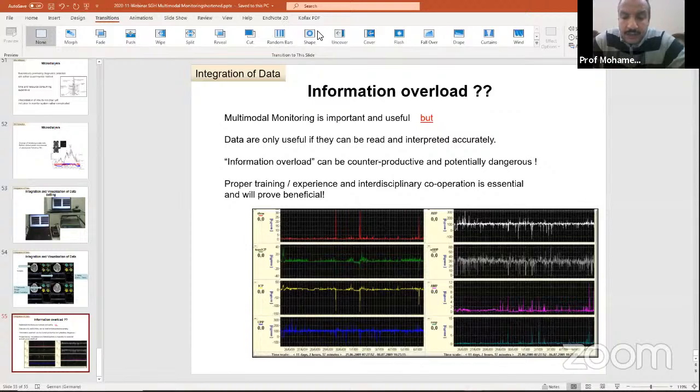You mentioned in your first slides that there is no replacement for the clinical examination. So if your readings are showing low oxygen tension and high ICP, will you go directly for surgery, or do you make a clinical assessment before you push your patient? Because sometimes it will be a late intervention or of no value, and this increases the many bad outcomes from decompressive craniectomies, because they are basically done for helpless or hopeless patients.